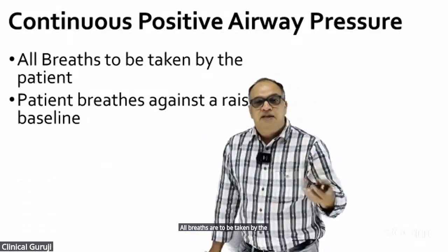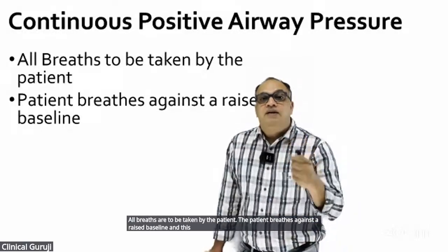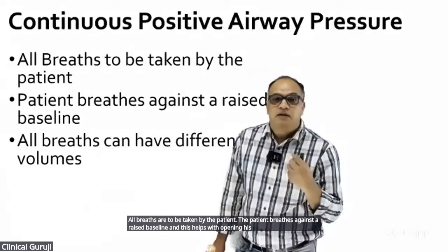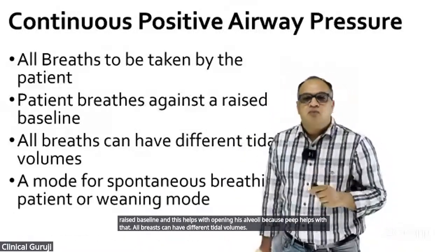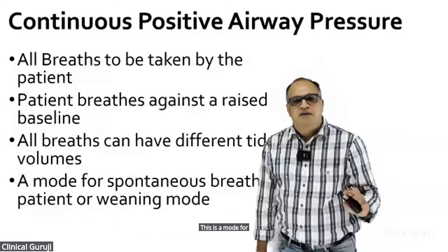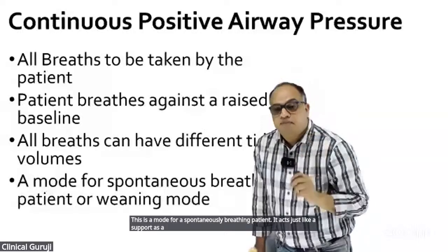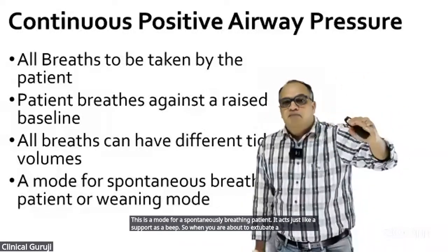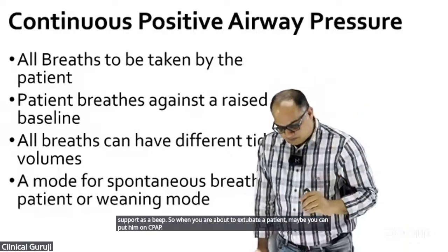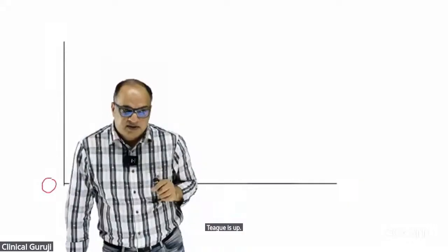The patient breathes against a raised baseline and this helps with opening his alveoli because PEEP helps with that. All breaths can have different tidal volumes. This is a mode for a spontaneously breathing patient. It acts just like a support as a PEEP. So when you are about to extubate a patient, maybe you can put him on CPAP. ठीक है sir? One more mode comes out of this.